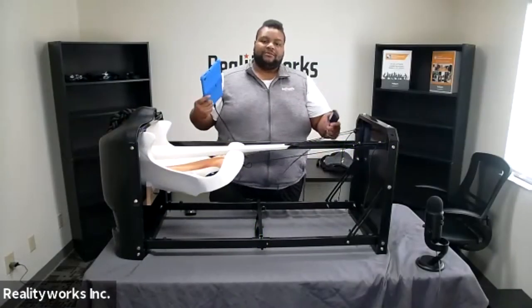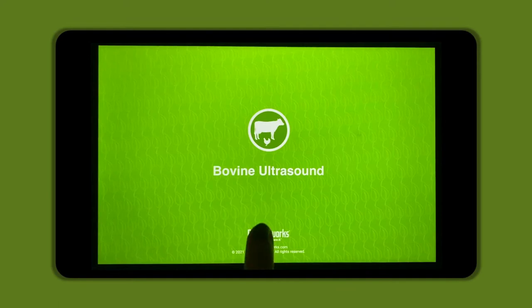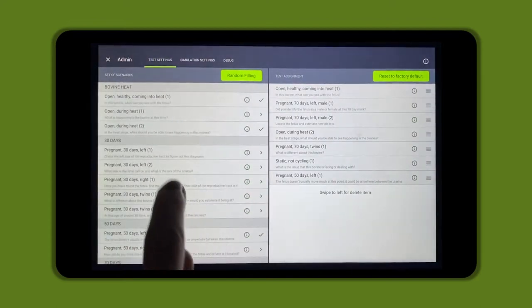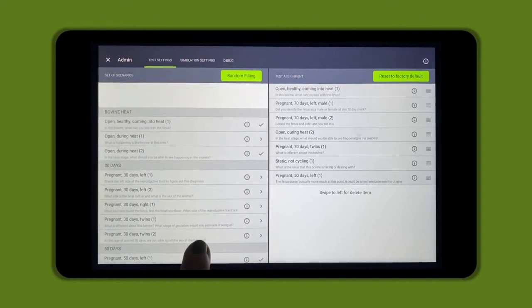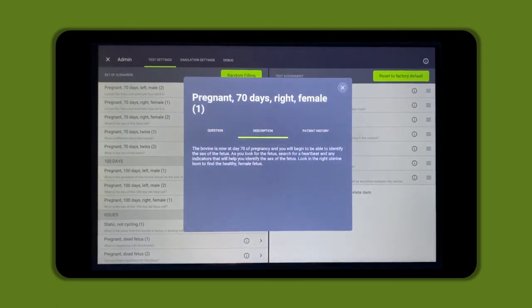Next, we're going to take a look at the ultrasound tablet and probe. To access the admin menu on the tablet, power on the tablet, turn on the software, and as the software is opening, tap the star on top of the RealityWorks logo — it'll open the admin menu for you. Once you're on that admin screen, you can tap where it says test settings in the top right corner, and this will list a group of over 20 different sets of scenarios for your students to practice and be assessed on. For each scenario listed on the left, you can tap the eye icon to review information. There will be three different tabs: the question the student will be asked and the answers — the correct one listed in green — a description tab showing the scenario description, and a patient history of the animal for that scenario.